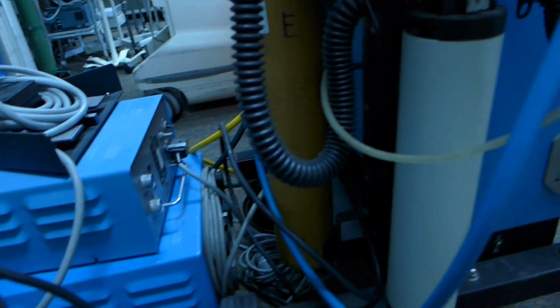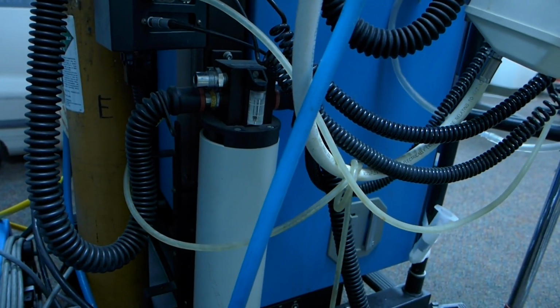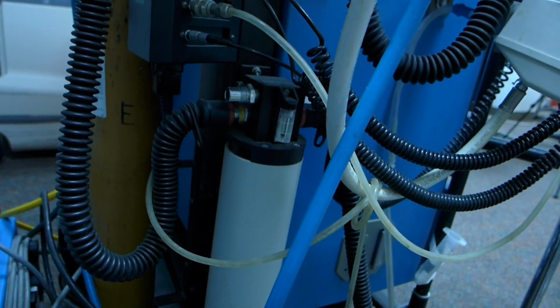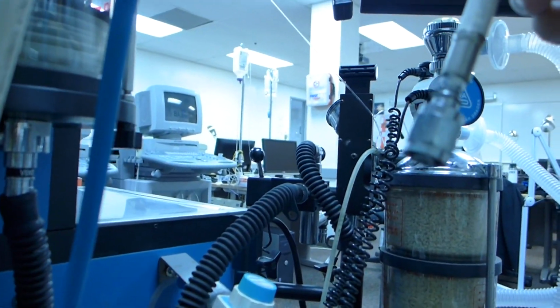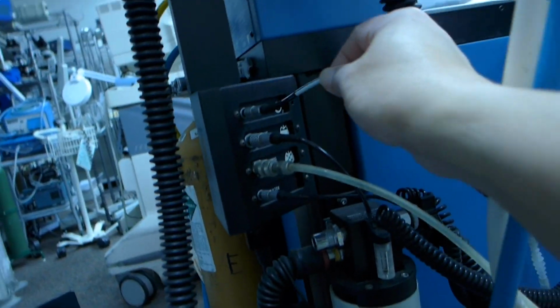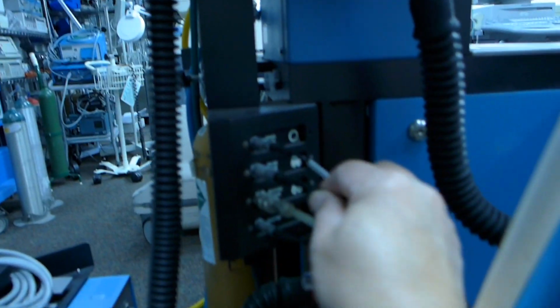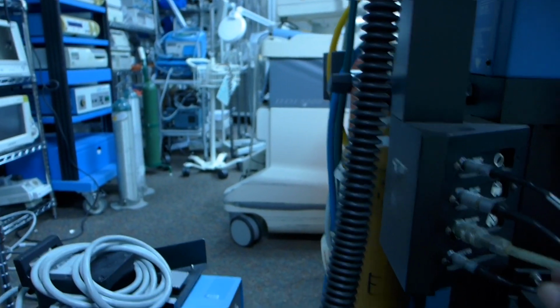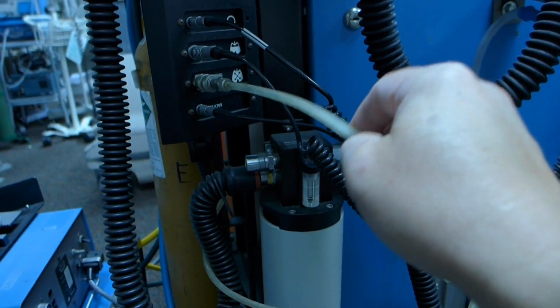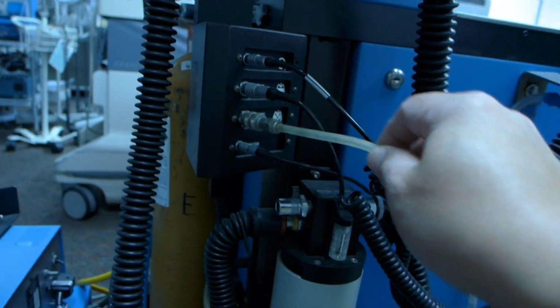so you can use it for suction. This is to suction mucus or secretions from the patient. This one can connect to the hospital suction system. Here in the connector, you can see we have the cable for the oxygen sensor. Then we have the spirometer, the electronic spirometer, and we have another one here. This is a pneumatic line. This measures the peak inspiratory pressure. This is the pressure line.